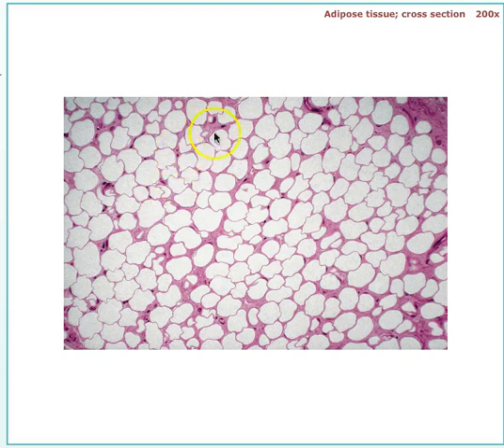It's not really doing work per se, so it doesn't really have a lot of organelles. So you'll see the nucleus. See all the nuclei here, these dark spots that I'm pointing at? But you see this almost Swiss cheese, very porous appearance, the telltale sign of adipose tissue. And we know that this is loose as well because look at all of that white space, okay? And we'll move on.